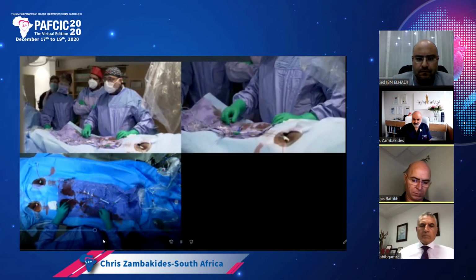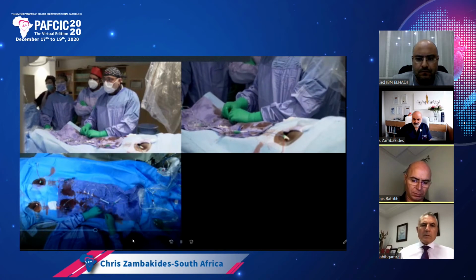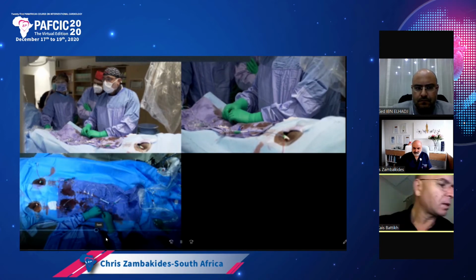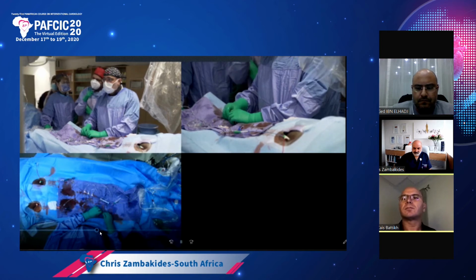Come back a little bit. Inject a bit there. Yep, that's the one. That's got to go that way.